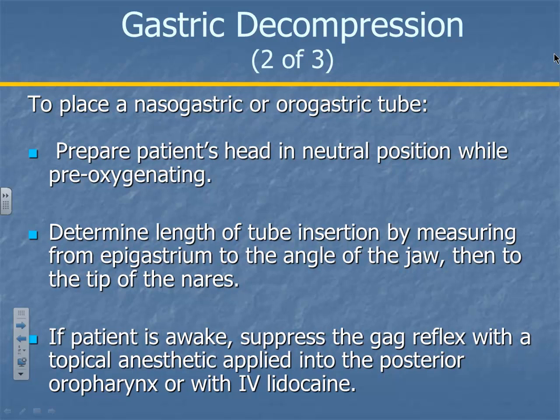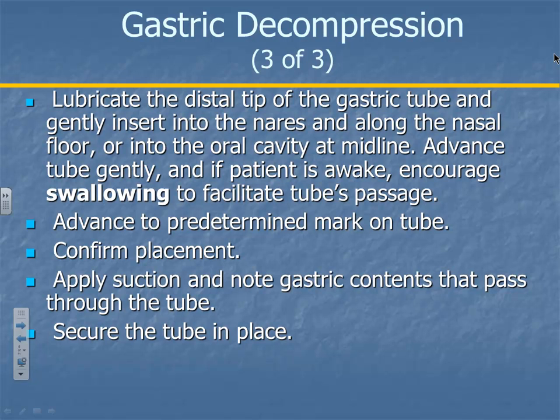All right, if the patient is awake, suppress a gag reflex with a topical anesthetic. I don't think we carry any sprays here, but some areas will carry a spray so you can anesthetize that with some lidocaine or something. Okay, I already said that.